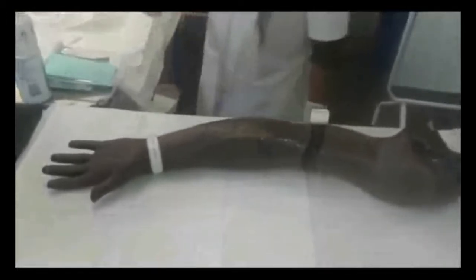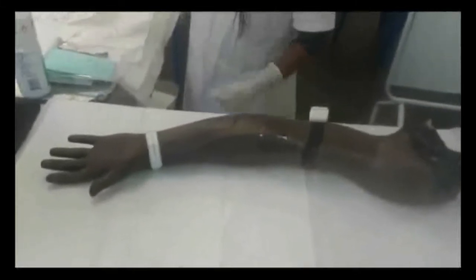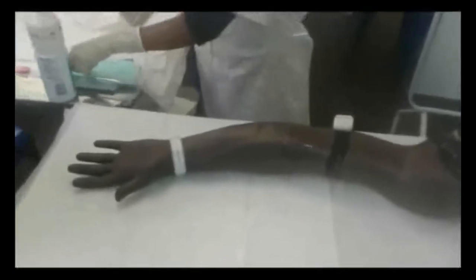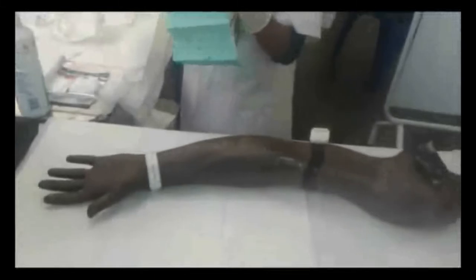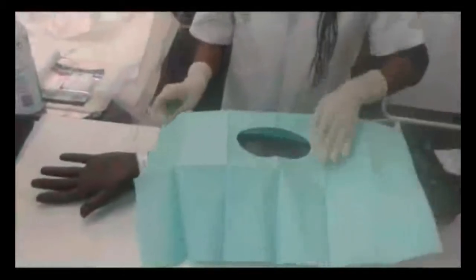Then proceed to clean your site of infection. When you're cleaning, try to go in circular motions, going outside from the point of insertion. Make sure while you're cleaning, you are very generous and clean a broad area to ensure that the whole area is actually free from any germs. Next, you prepare your sterile window. This will help you get a good visual on your site of insertion, but it will also decrease any chances of contamination from the area surrounding your antecubital fossa.